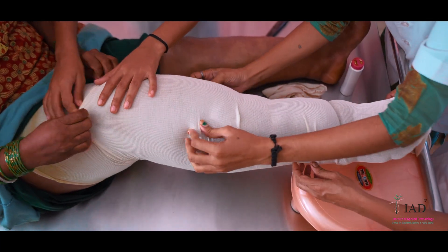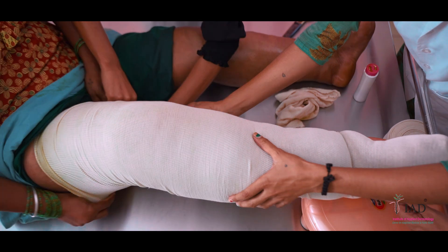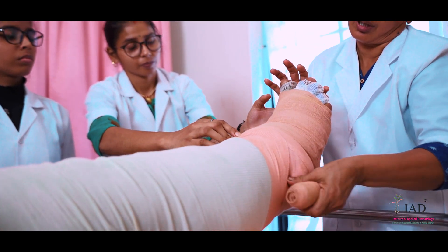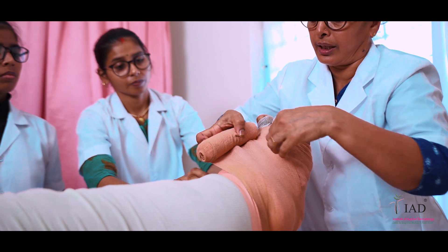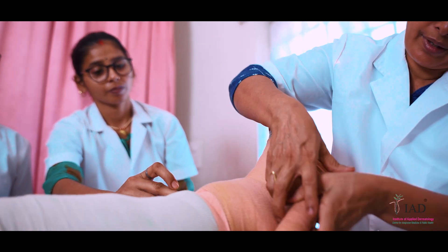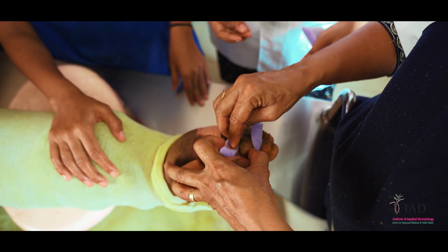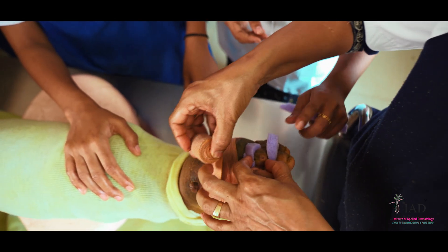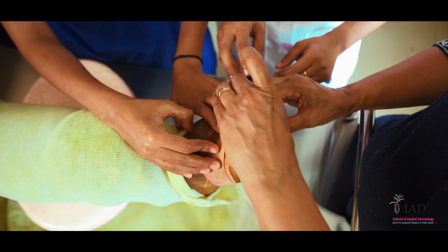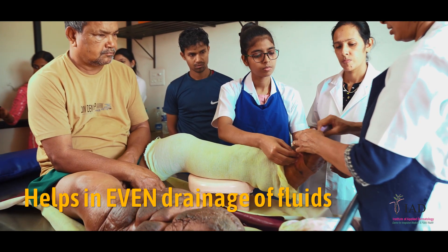A cotton cloth or ribbed cotton stockinette should be worn before tying bandages. This prevents the direct contact of bandage with the skin and helps to avoid soiling of the bandages with oil. First, insert the molds to separate the skin folds as advised. It helps to bring the skin folds to the same level and helps in even drainage of fluids.